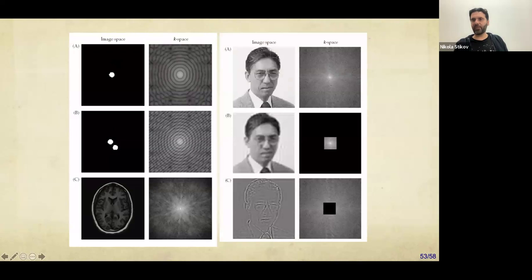You want to work with simple two-dimensional images. This guy here is Seiji Ogawa, the guy who invented functional MRI. You take a Fourier transform. This is what you get. You want to take a look at just the low frequencies of Seiji Ogawa. There it is. You want to take a look at the high frequencies of Seiji Ogawa. There it is.